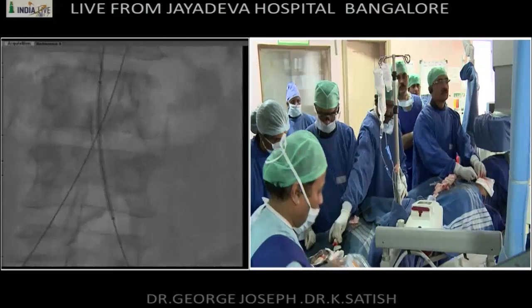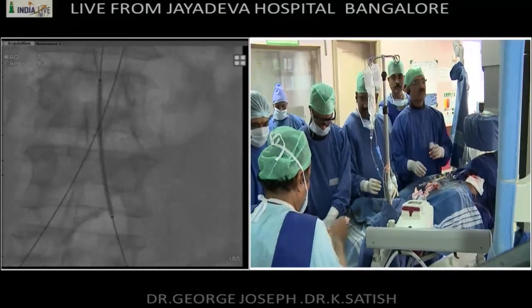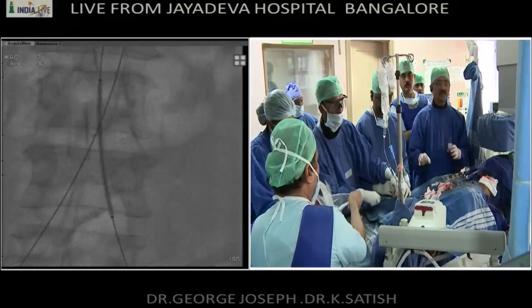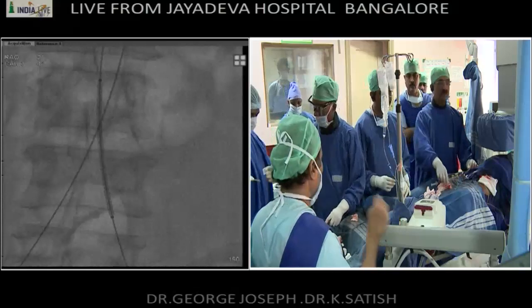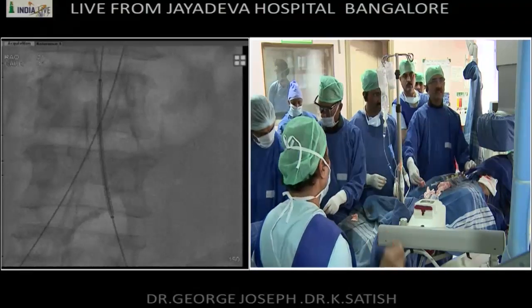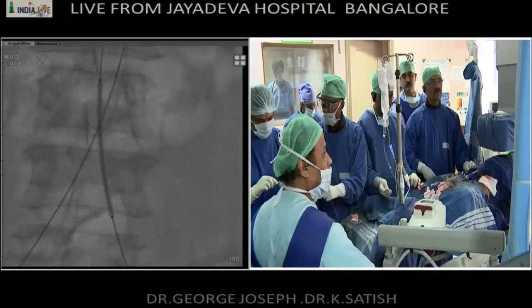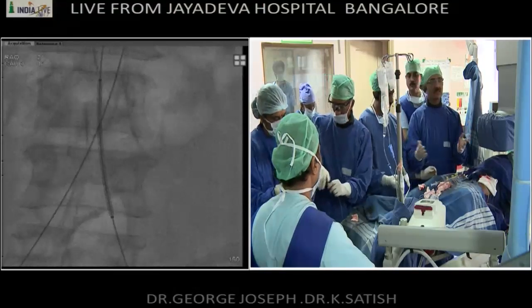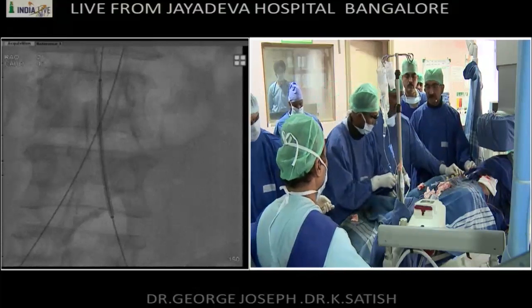You don't want to dilate with the balloon now at the bifurcation? No, we'll directly stent. There is no need to balloon. Because the right is totally occluded, we're going to protrude this junction a little bit into there. This is a balloon expandable stent, 8 mm diameter and 59 mm length.